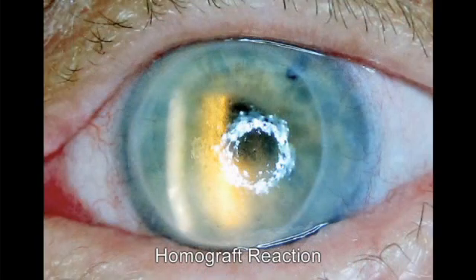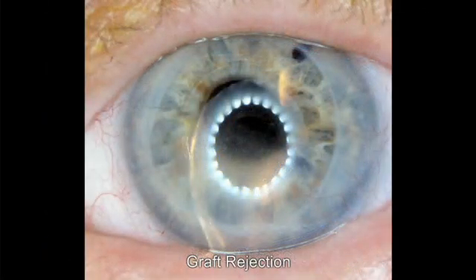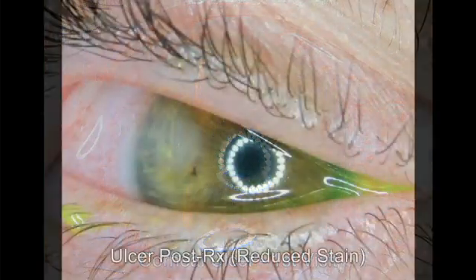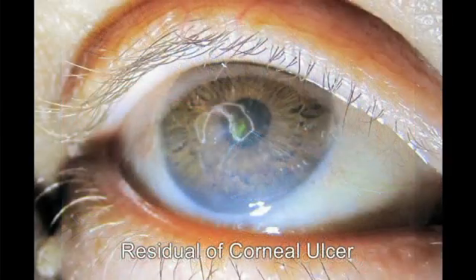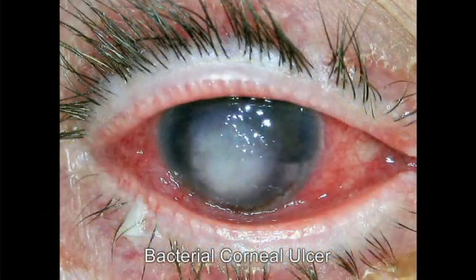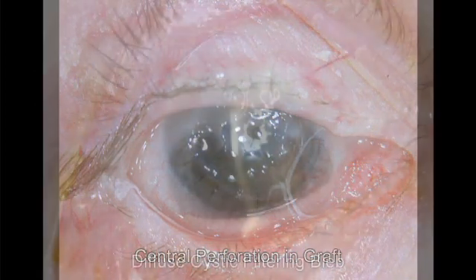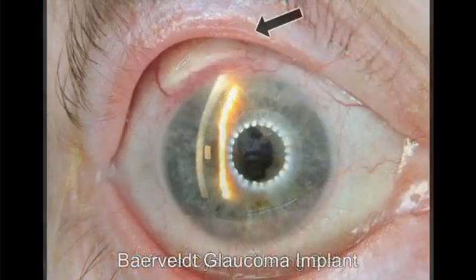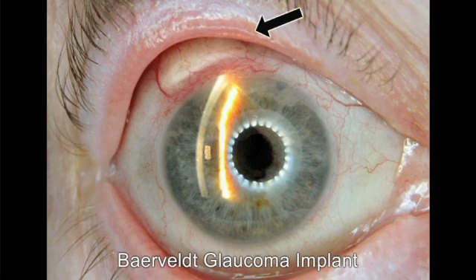By recording many of the images myself, I am assured that I have the optimum photograph and I have it immediately available for patient counseling. I have found that the patient's interest is greatly enhanced by viewing a photo of his or her own eye.